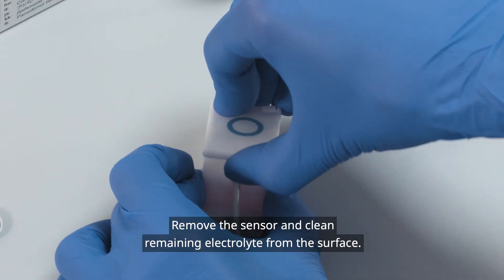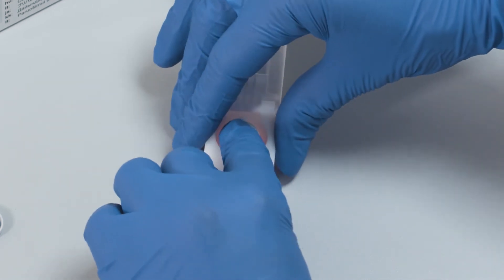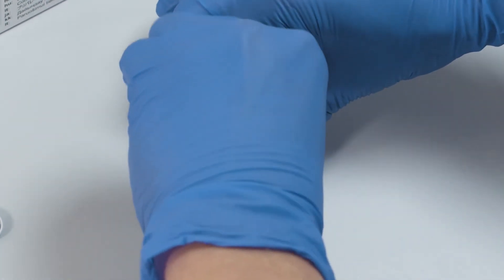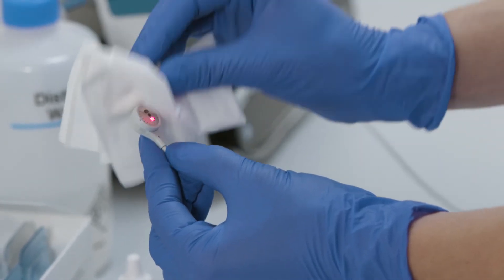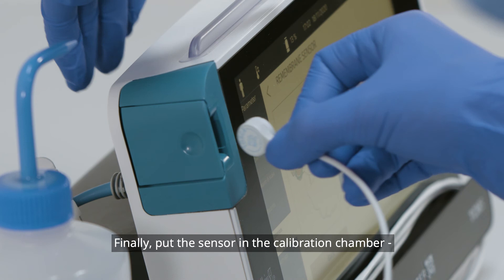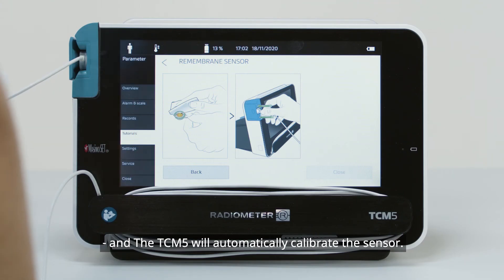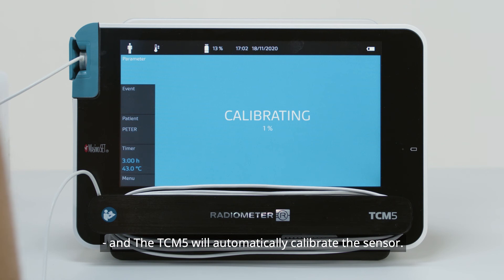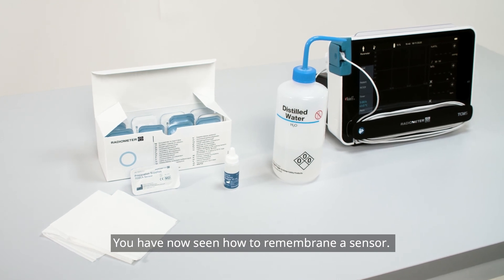Remove the sensor and clean remaining electrolyte from the surface. Finally, put the sensor in the calibration chamber and the TCM-5 will automatically calibrate the sensor. You have now seen how to re-membrane a sensor.